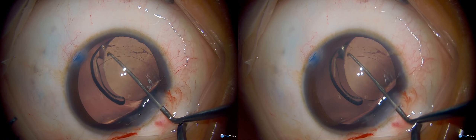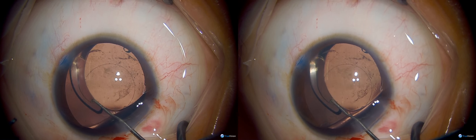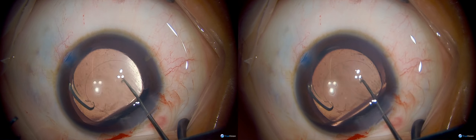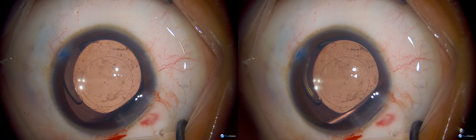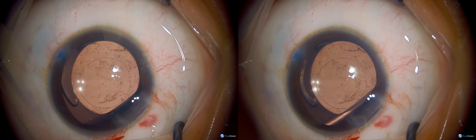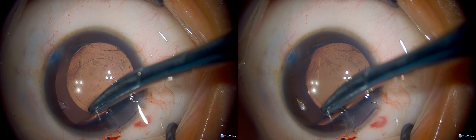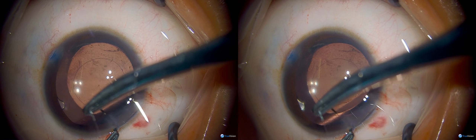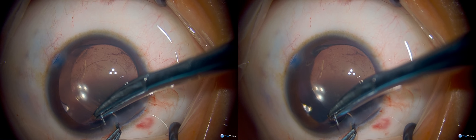This one's a little on the small side even though it's perfectly round. Having this slowly opening lens allows you to maneuver into position when the capsulotomy is small, when it's irregular, when there's a risk of extensions, or even if you have an opening in your posterior capsule. This particular Alcon lens is really ideal for these circumstances and is the lens of choice for pediatric cataract surgery in the US.